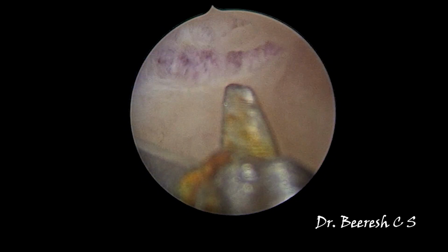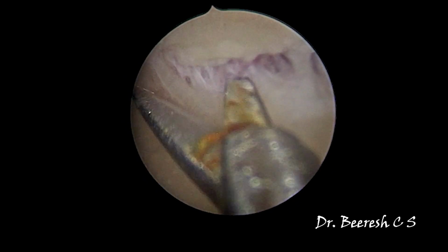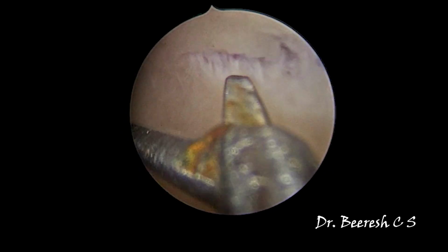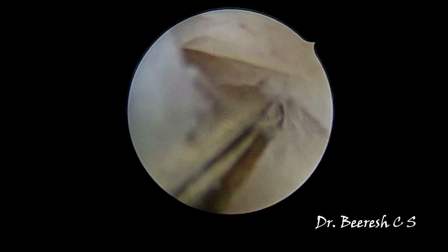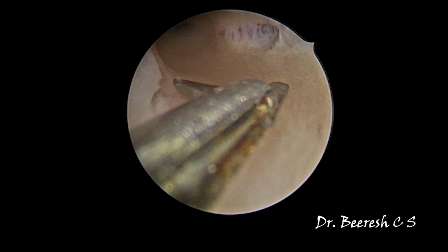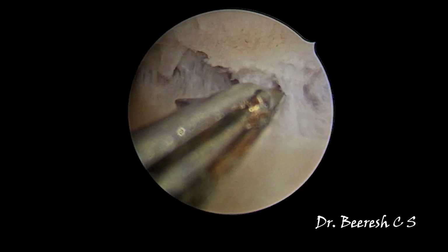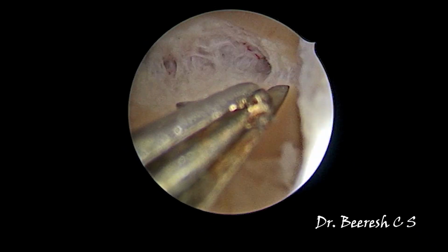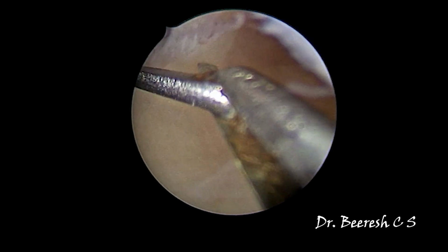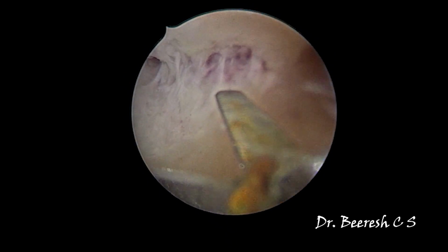So initially we plan to do a fundal metroplasty to release the septate component. Here you can see gentle strokes of the scissors, keeping the line of cleavage between the two interostial line. Small cuts are being made to release the fundal component.